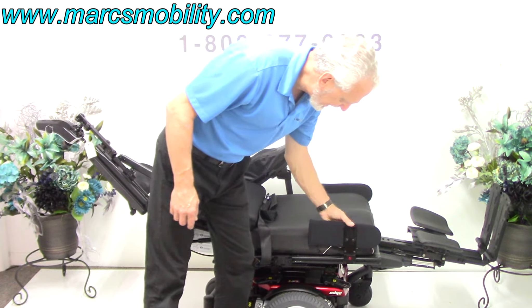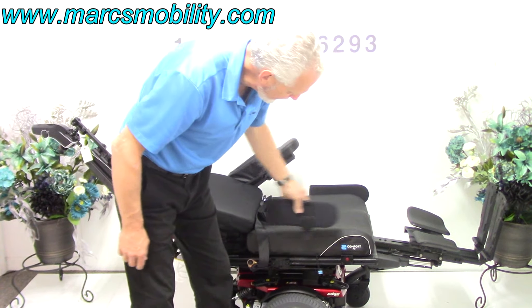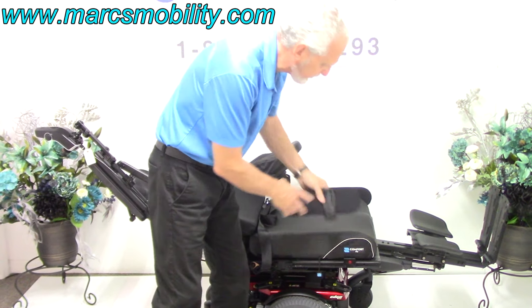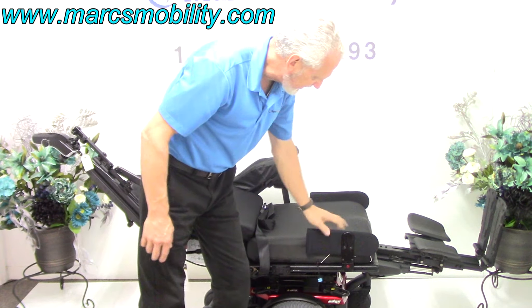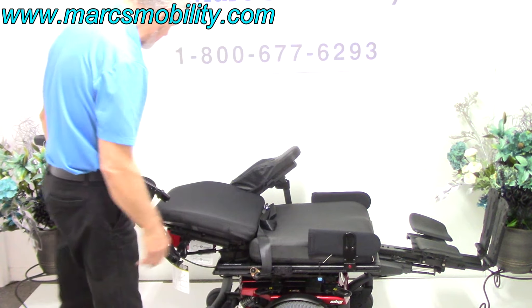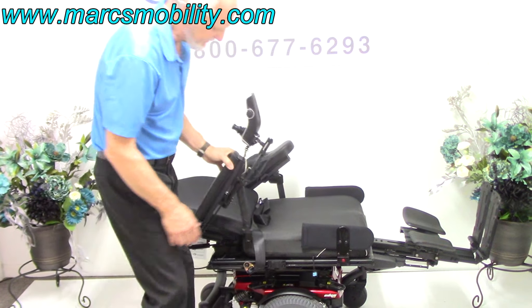You've also got lateral pads here. These lateral pads can be removed, or they can be moved up and down the shaft. They're nice — they keep your legs inside on the foot plate. They can be raised up higher or lowered all the way down.